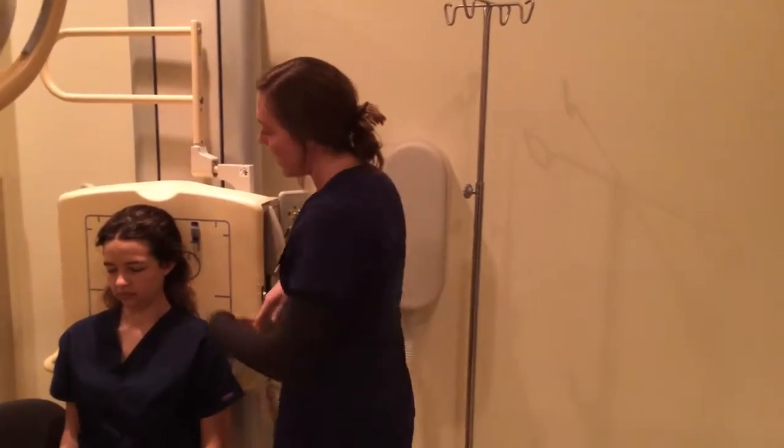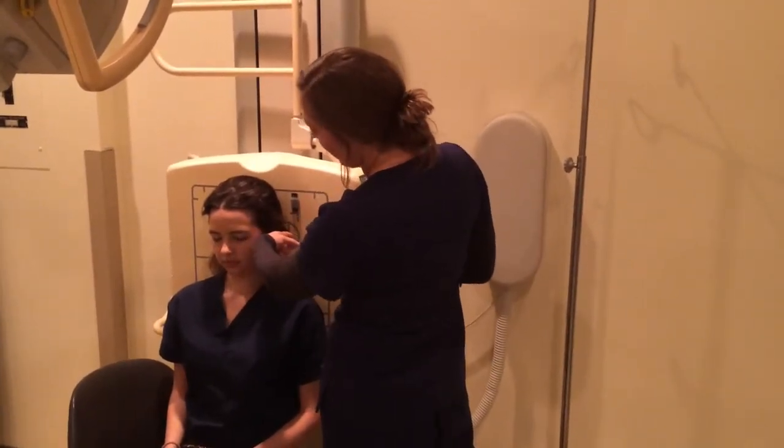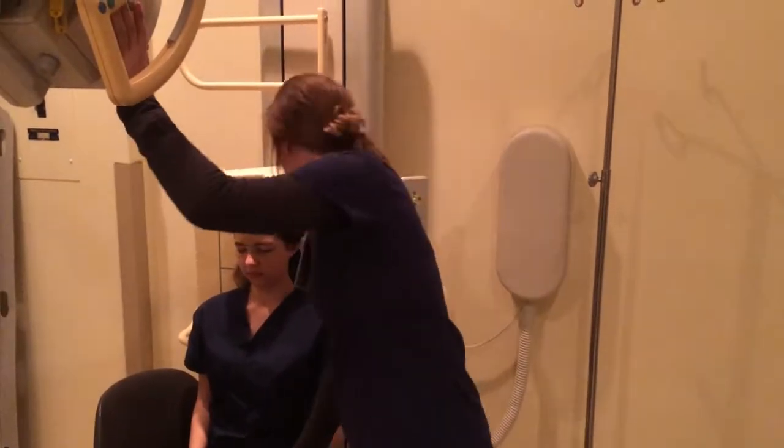So the next projection we're going to do is the AP axial, also known as the Towne method. Because our patient is able to extend her neck down, making the OML perpendicular with the IR, we're using a 30-degree caudad angle. I've also shielded my patient.